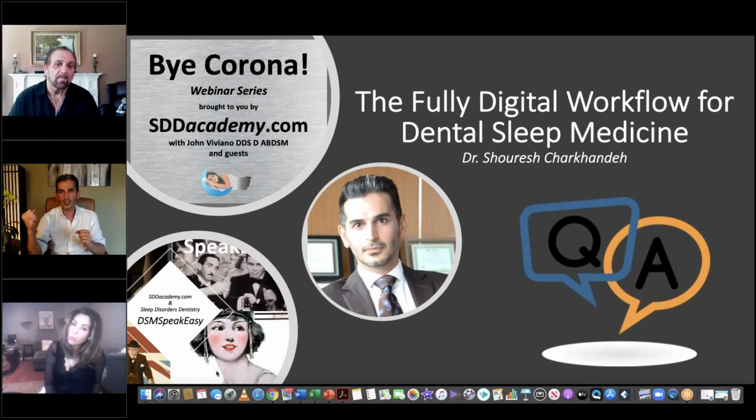An appliance has to work and it has to be comfortable. Those are two different sides. You can make an appliance that is very efficacious, but it's not comfortable because the patient is overclosed. And you can have an appliance that is very comfortable, but it's not efficacious because the patient is not a respondent. What we like to do in our clinic is just marry them together. So you want an appliance that is efficacious. How do you figure that one out? By knowing the response from the Matrix Plus and all the other stuff.